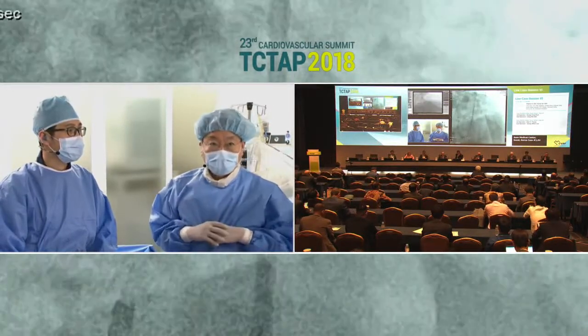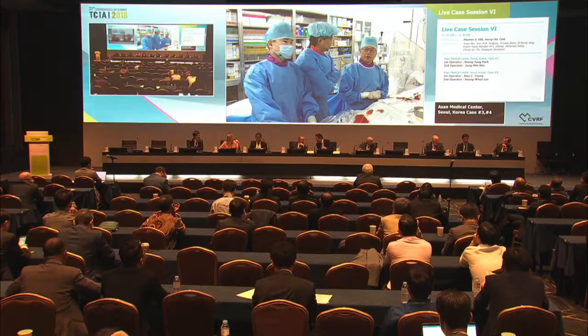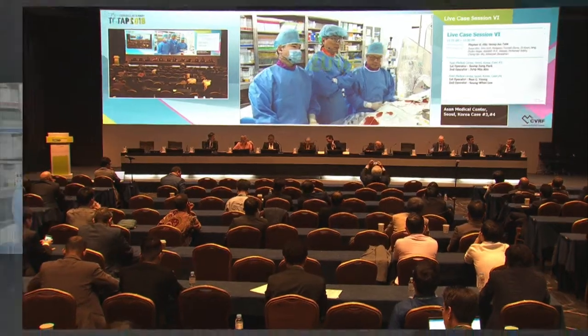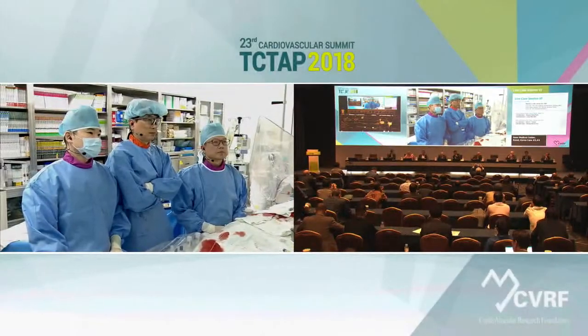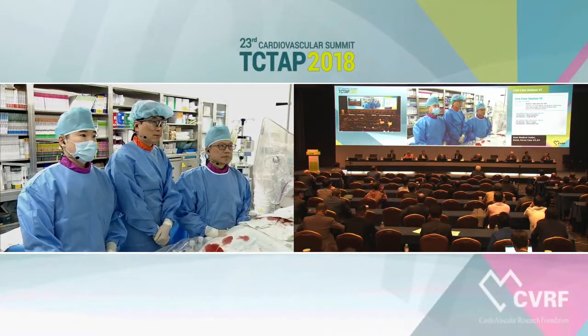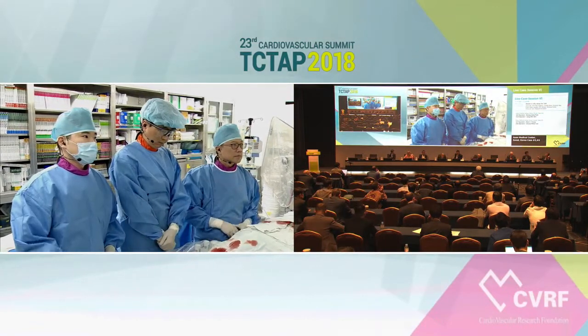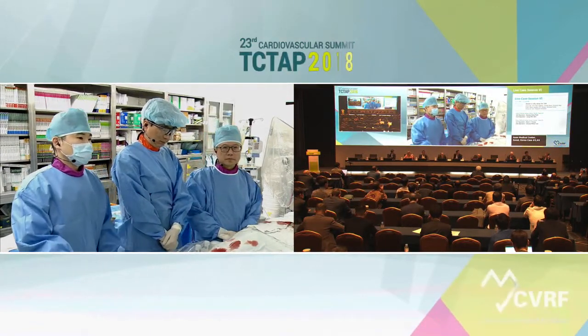All right, thank you. Right, do you want to do more cases? Thank you very much. If I can, just a quick comment related to OCT. In my practice, I use intravascular imaging in 70% of my PCI, 90% OCT, 10% IVUS. In this particular case, I would have used IVUS because there wasn't really a reference for the left main, and with OCT you have a problem of finding a reference.